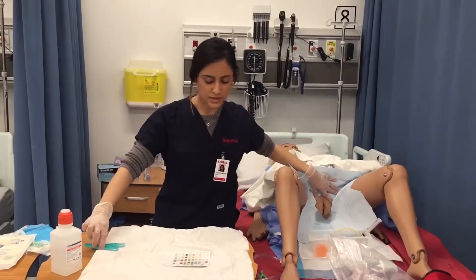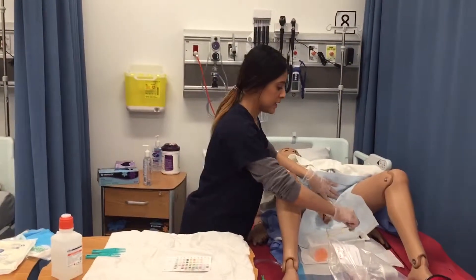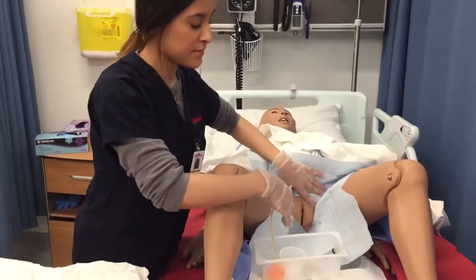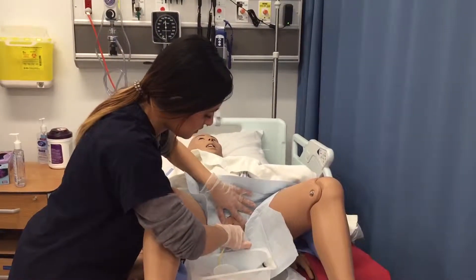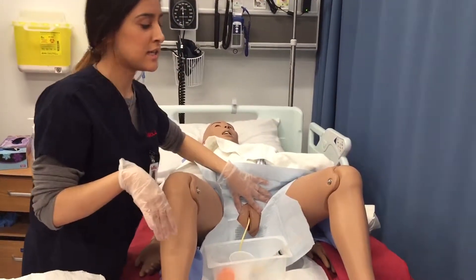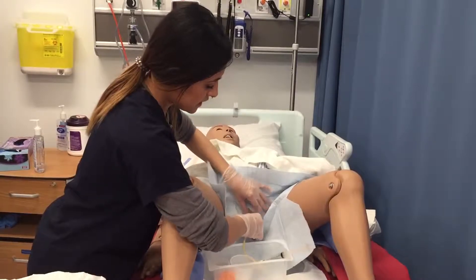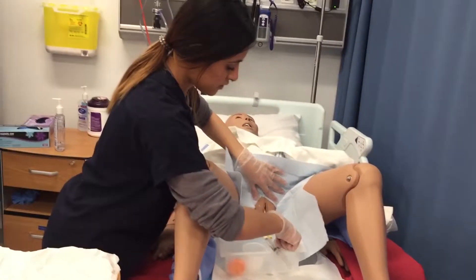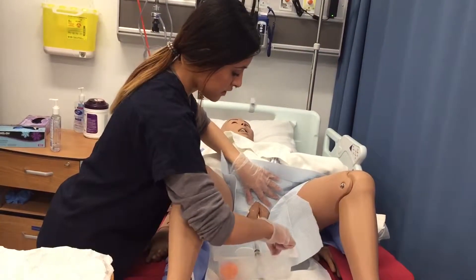Now I'm turning my attention to the catheter and I'm going to slowly insert it. I'm going to ask my patient to bear down as I insert. I know from the previous charts that she's already had her pain medication, so she's comfortable. As I'm inserting the catheter, I'm looking to see if there's any urine coming out. I can see a little bit of urine, so I'm going to insert it two more inches before stopping. Urine is now coming out.